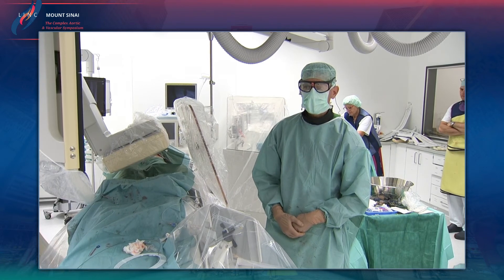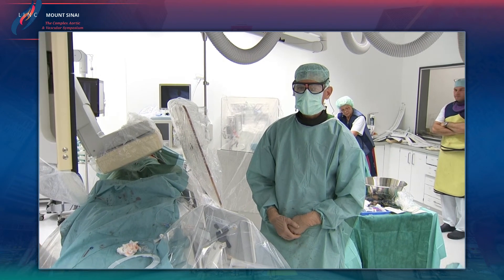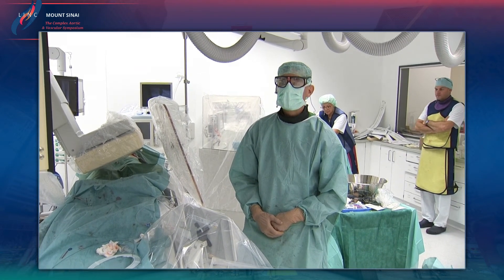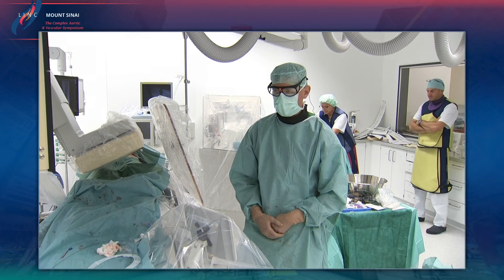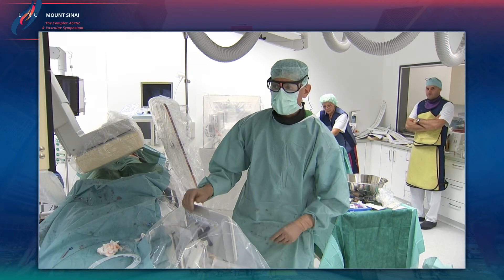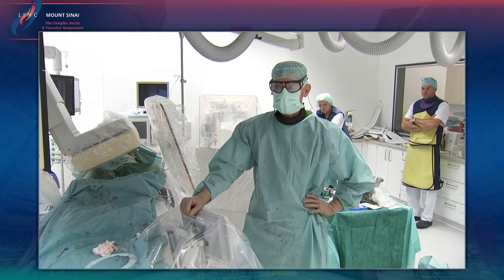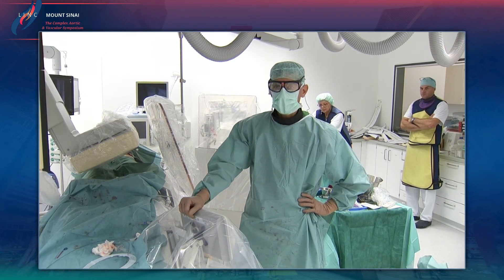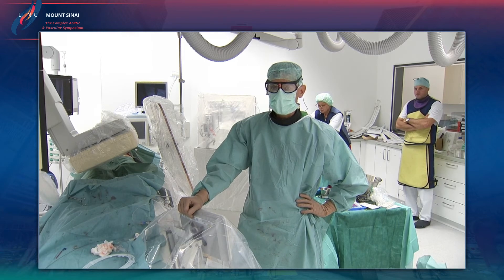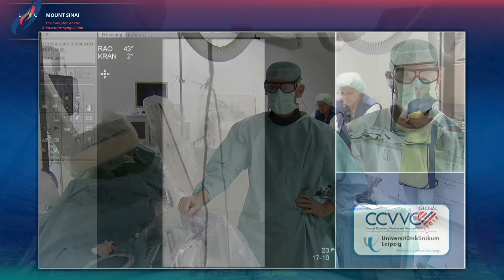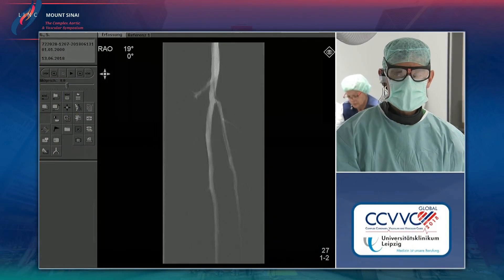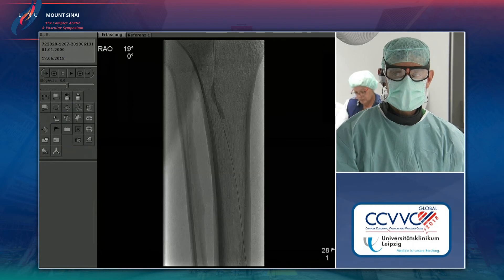Before starting the next case, the team briefly returns to show the final result of the previous case. After ballooning, atherectomy was performed with a TurboHawk, and Sven scrolls back to the final images.